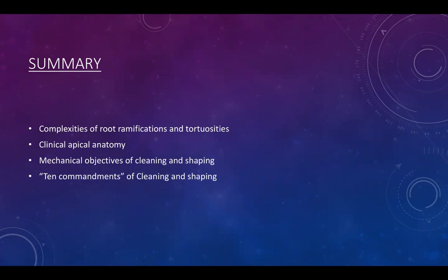Also, when we see the anatomy, we might think of that. In some ethnicities it may be more prevalent than others, and the canals might be really close to each other. We might think it's only one, and actually they're completely separate ones. I would say in cases like that, explore your initial x-ray very well. When you find one canal, if you cannot get the other canal, always prep those canals and take an angle x-ray. That will tell you if that cone or file is in the center of the canal, then you have in that root only one canal.